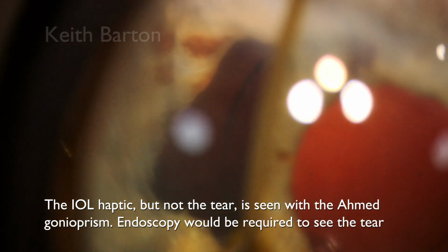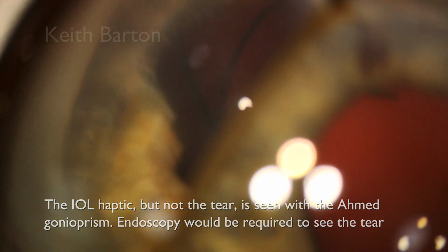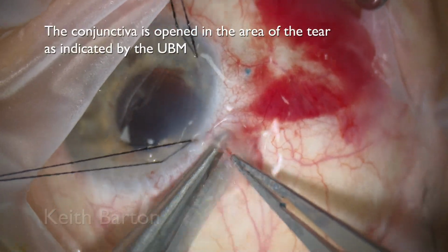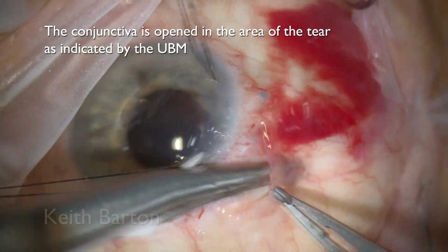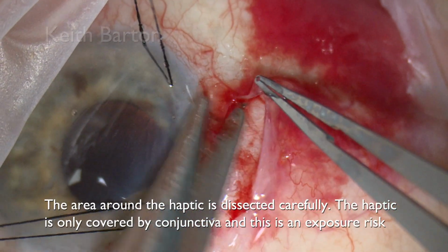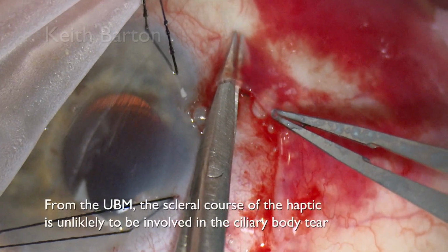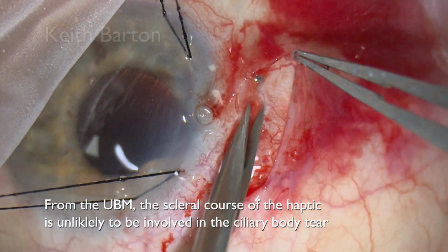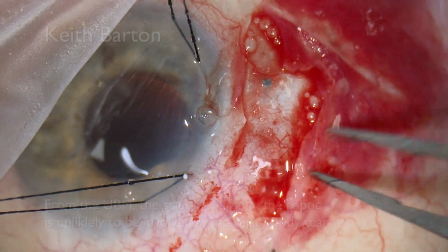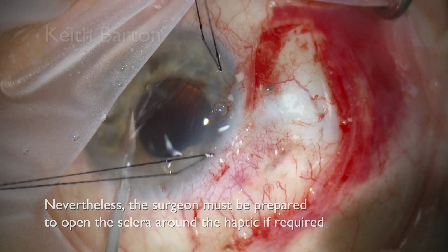The IOL haptic, but not the tear, is seen with the gonioprism. Endoscopy would be required to see the tear. The conjunctiva is opened in the area of the tear as indicated by the UBM. The area around the haptic is dissected carefully. The haptic is only covered by conjunctiva, and this is an exposure risk. From the UBM, the scleral course of the haptic is unlikely to be involved in the ciliary body tear. Nevertheless, the surgeon must be prepared to open the sclera around the haptic if required.